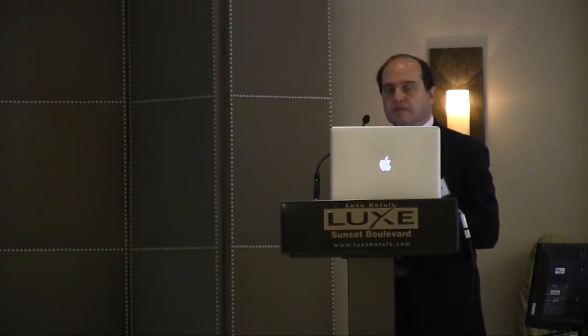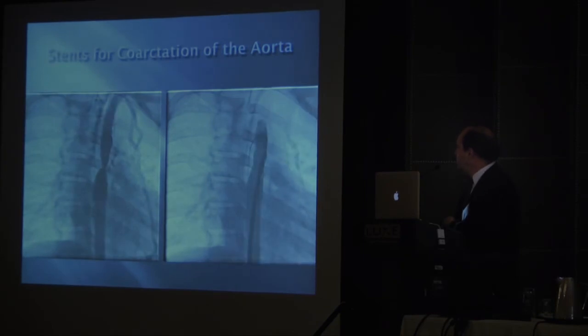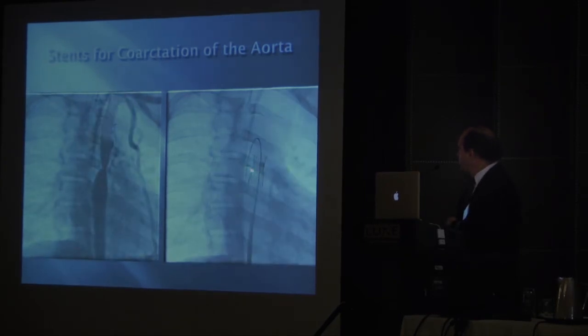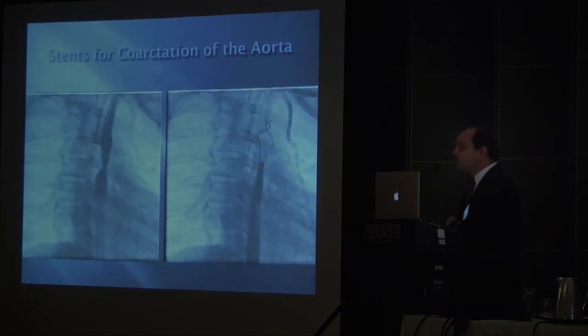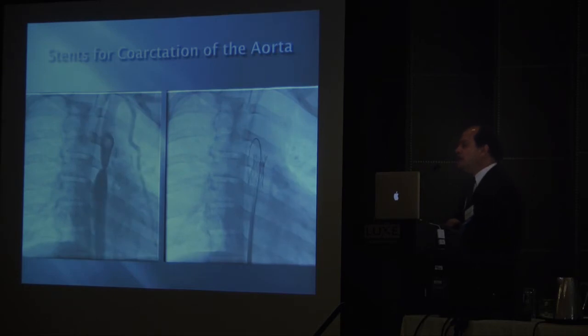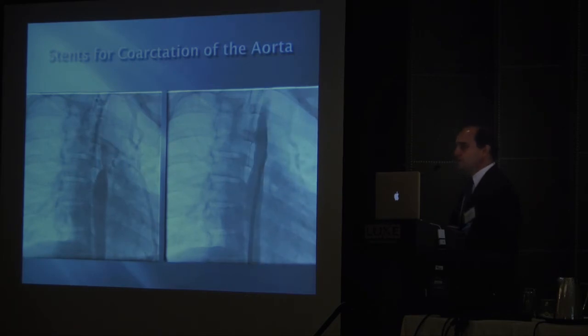This is a patient with a fairly severe coarctation of the aorta. You can see all the arterial collaterals the patient has been depending on for flow to the descending aorta. The obstruction was crossed and an uncovered bare metal stent was placed. I hope this is not our usual practice anymore, because I think this is much better and safer to address with covered stents than bare metal stents.